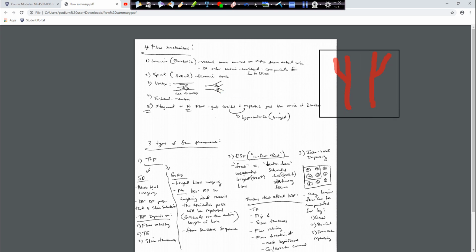So here's our field of view, and then our slices look like this going up. You can see here how we have axial slices that are perpendicular to our blood flow. That's what we're talking about, how we can compensate for that particular flow.